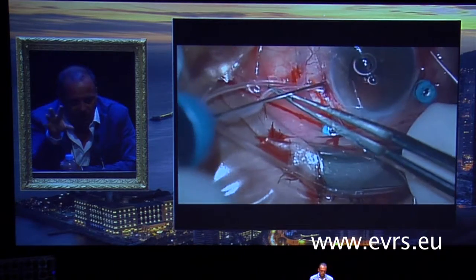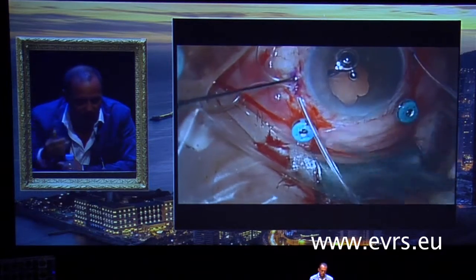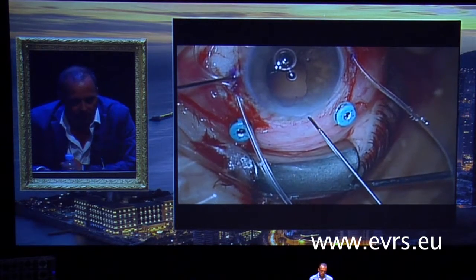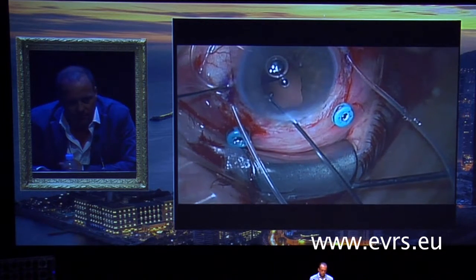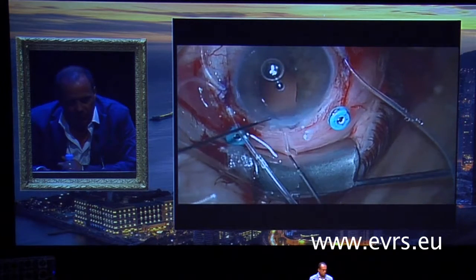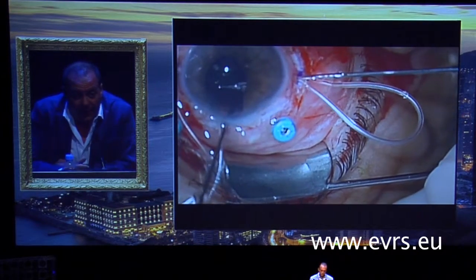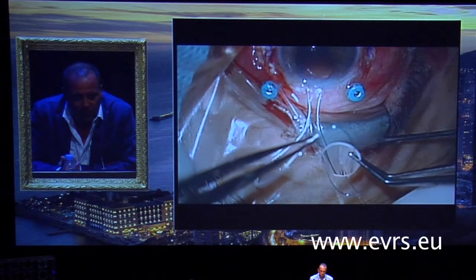Of course, this is a technique for when the eye is aphakic, so you put the IOL from the outside into the eye. So I take the tube outside the eye from the cornea tunnel, using another forceps. Okay, so now you have the way, this is on the other side, of course. And now you just have to put the two haptics into the tube.